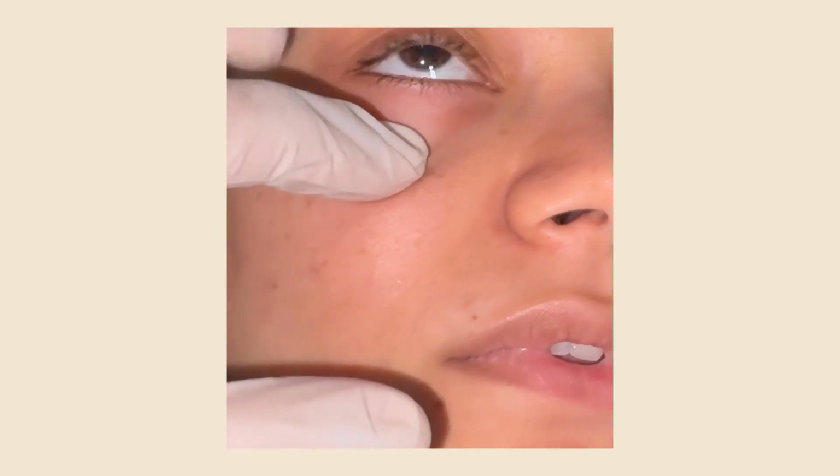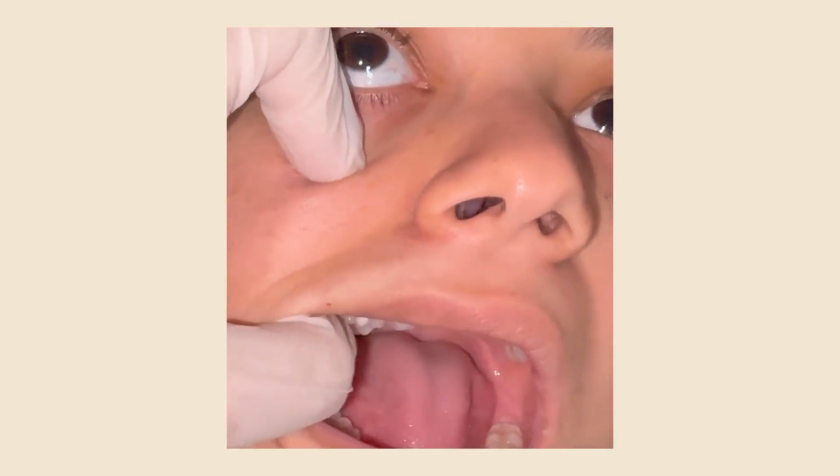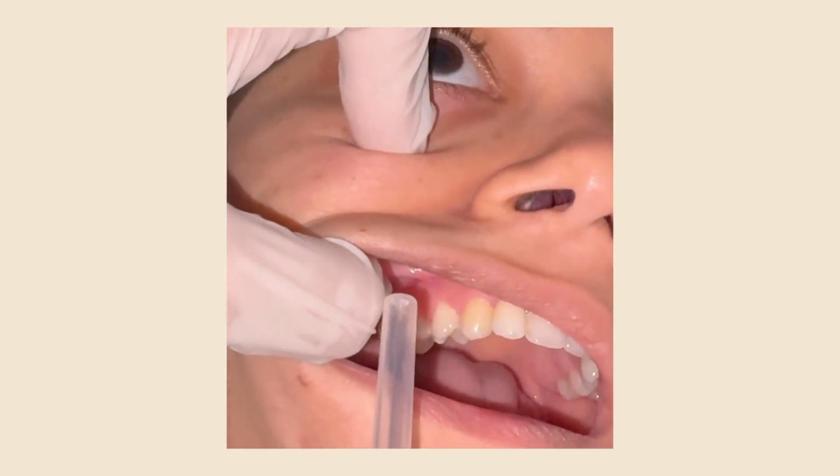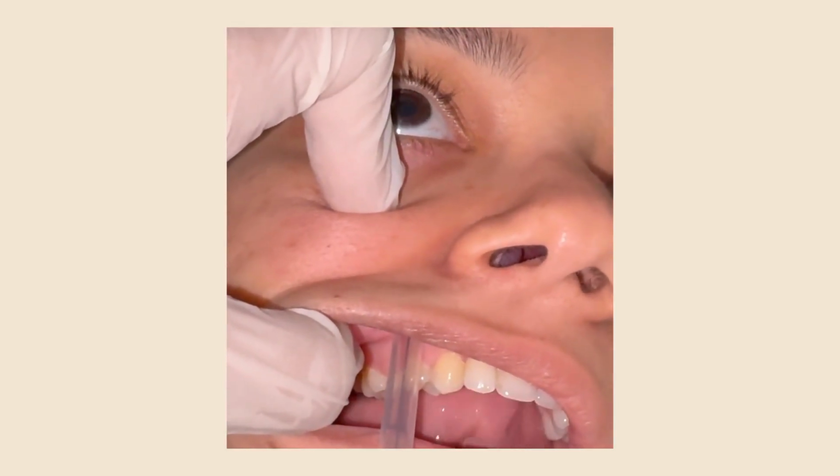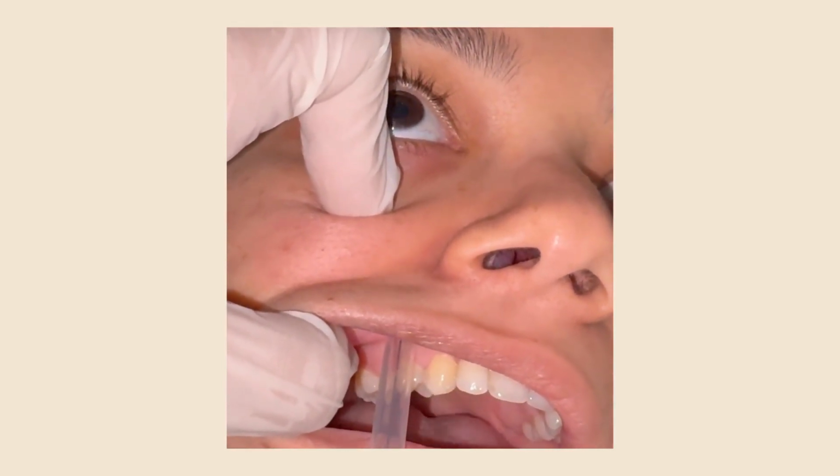This video shows us the live demonstration of infraorbital nerve block. The operator located the infraorbital ridge and notch and then, through the height of the mucobuccal fold over the first premolar, injects the syringe and deposits anesthesia.